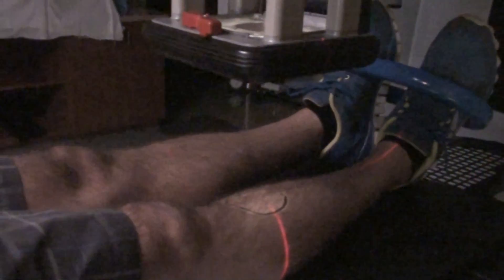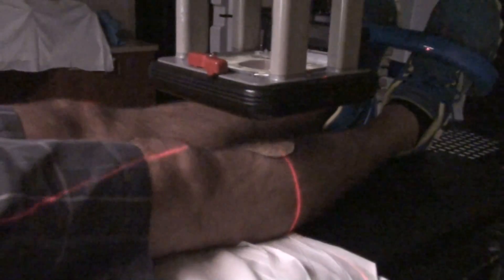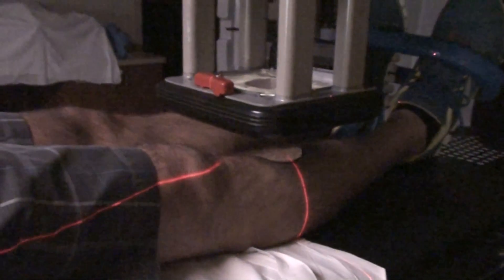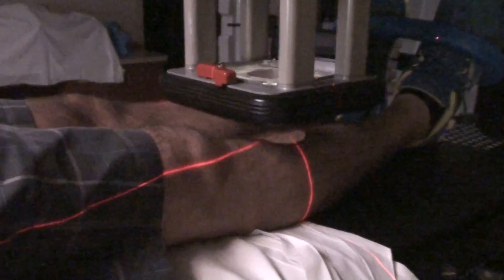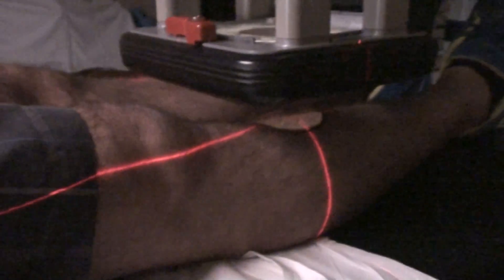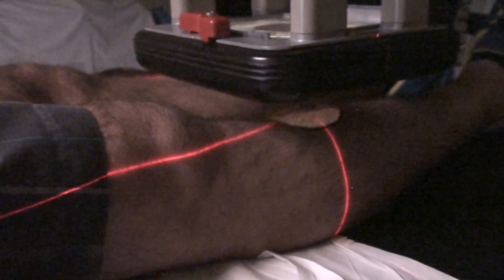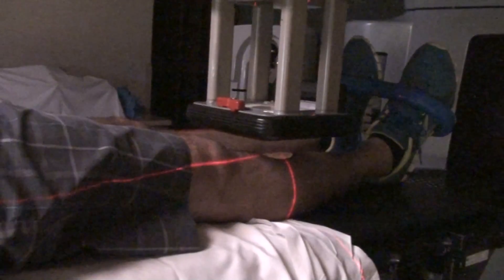You're going to move in and out and then up and down. You're going to go to usually 100 SSD unless there's bolus involved, and that will vary from center to center. I've used the laser flashing right across the top of the field to get to 100 SSD. Now we have everything lined up together. We're already set — we can leave the room and treat the patient.